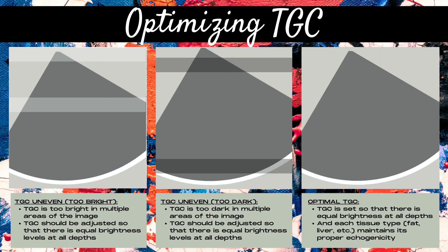Now let's talk about how to optimize the TGC control. In the far left image, the TGC is uneven — it's too bright in certain areas. The TGC should be adjusted so that there is equal brightness at all depths, and all tissue types maintain their proper echogenicity.